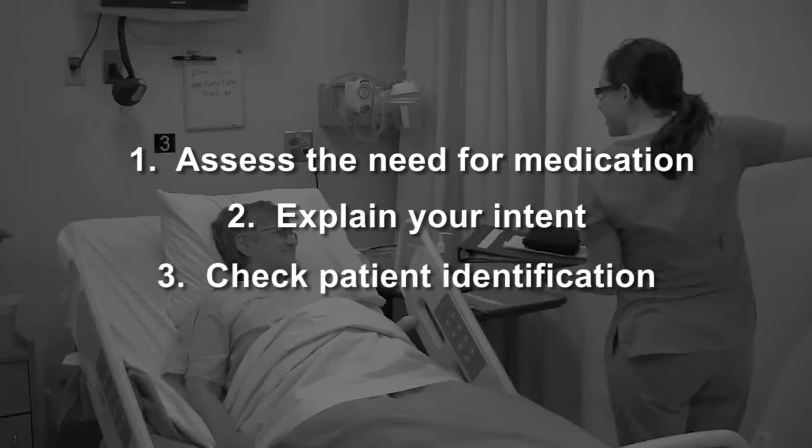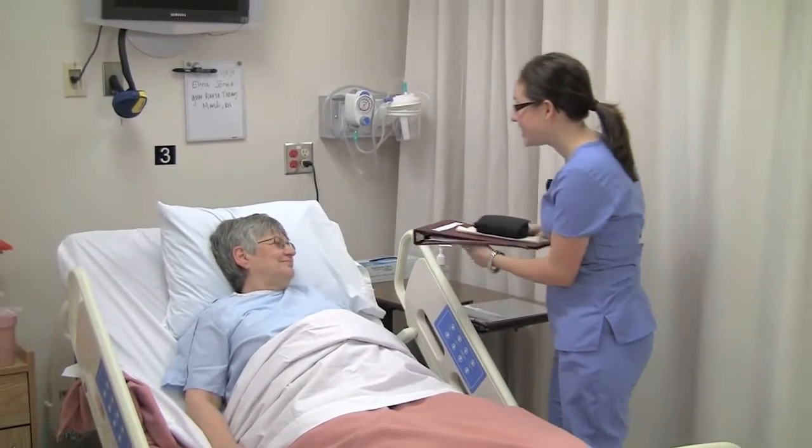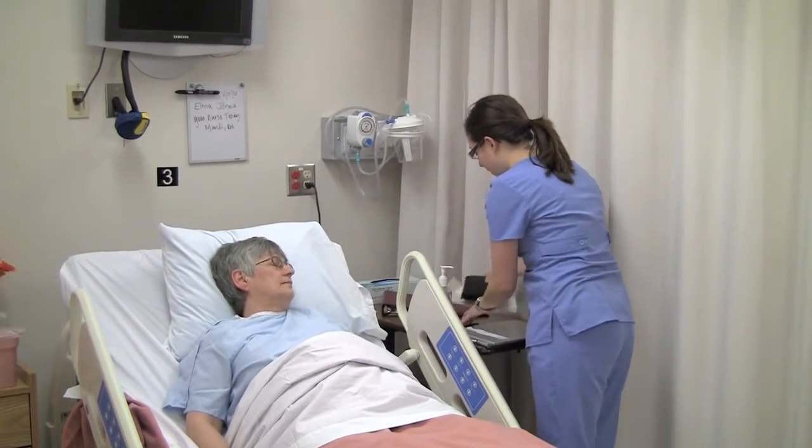Explain what you are doing and check the patient's ID. Hi there, Alma. I need to take your blood sugar. Can you tell me your full name and date of birth? Alma Jones, 2638. Thank you, Alma.